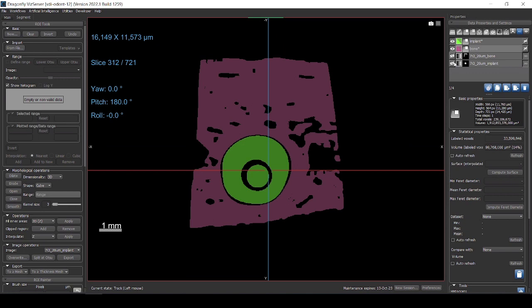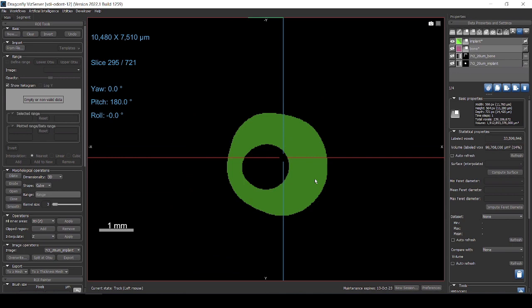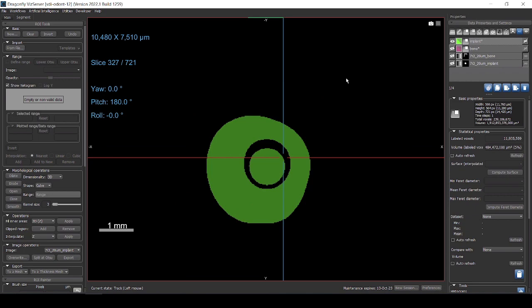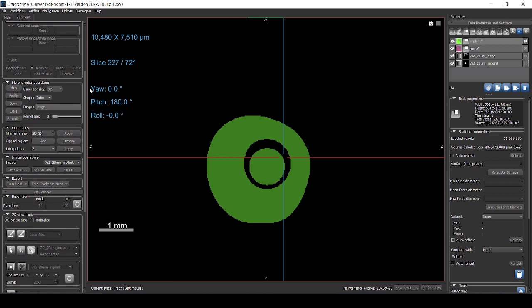So I'm going to get back to this view. Let's just view the implant. And because of this gap here, I will show you how to get rid of this. So if we select the implant and we go to the segment tab, down here we have some operations. And one of them is fill in areas. So what you can do here is you can select which kind of filling you want. In our case, what we want to do is to fill in the Z axis.